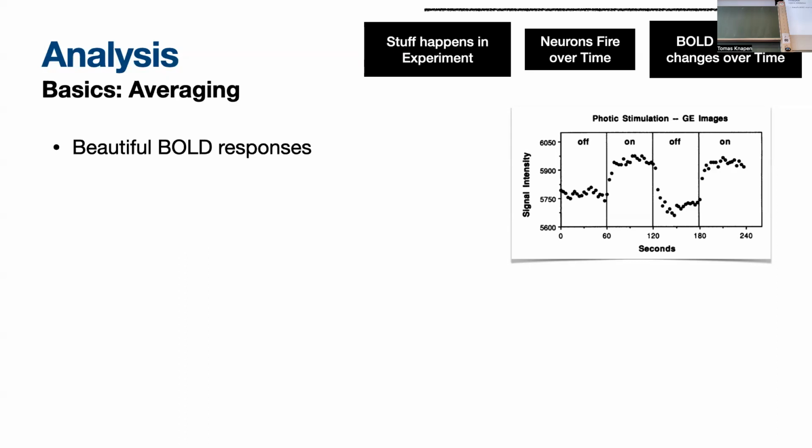Like I already said, the number that you get out of the scanner is in principle meaningless, right? We have these numbers, and we see that when the stimulus is off, it's low, and you get this beautiful BOLD response. It goes up, right? And then the stimulus is turned off, and it goes down, on, it goes up, right? Beautiful over the course of 4 minutes, right? We have a minute-long flickering checkerboard is what people use in this type of context. It's headache material, but it gives you a strong BOLD response.